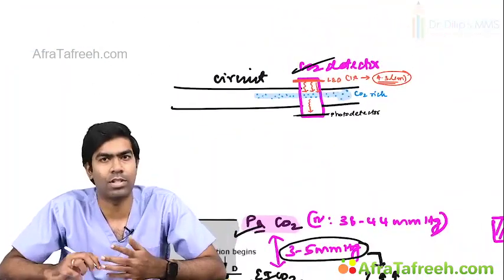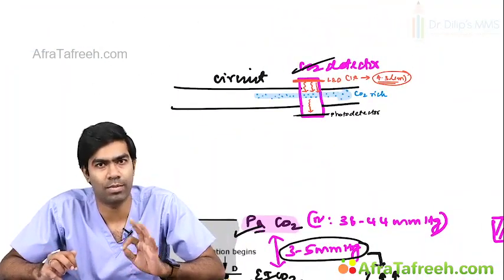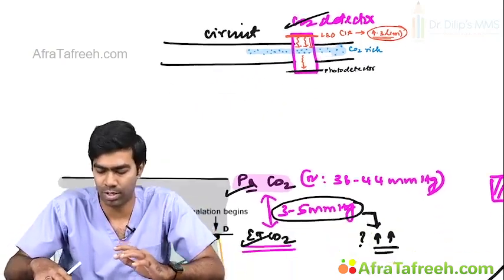Depending on how much of this 4.3 micrometer light reaches the photodetector, it is processed, sampled and analyzed by the electronics inside the detector, and they will tell that this much carbon dioxide is there. Very, very simple process. This is how they detect carbon dioxide. And the one important point is that you have to remember the 4.3 micrometer for the exam.